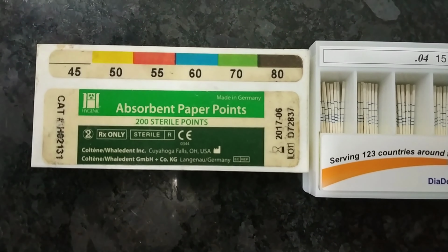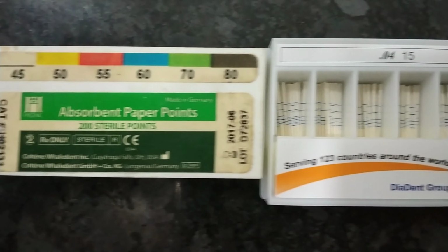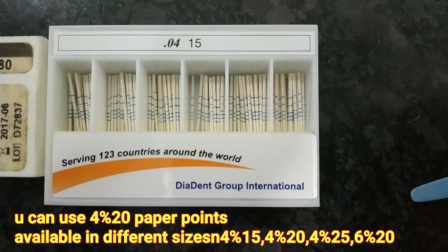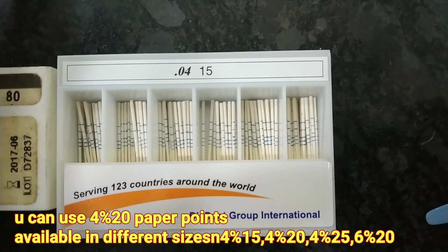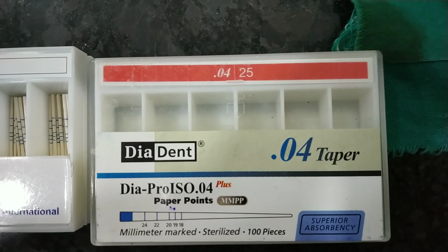Similar to the gutta percha, we have the absorbent paper points, ISO paper points 45, 50, 55, and we have the 4% paper points as well. So we are going to use the 4% 15 paper points. So it's available in various sizes. I use the 4% 15 ones or 4% 20 ones, 4% 25 paper points.